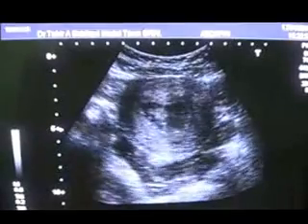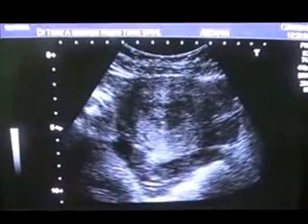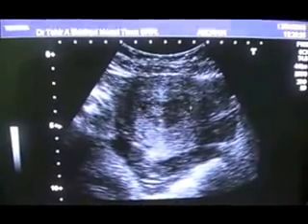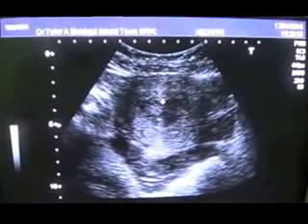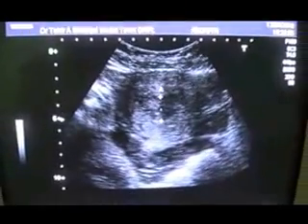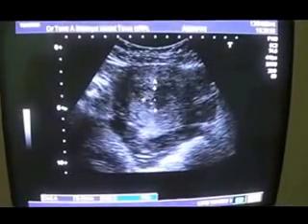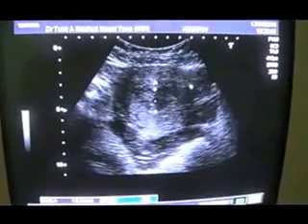This is the transverse section in which you are seeing the uterus. This is the uterus, and this is the endometrial canal. You can see different strength internal echoes, and the endometrial canal in this view measures 18.8, which is definitely dilated, and with dilation it shows different strength internal echoes. No pathology is seen relating to the myometrium.